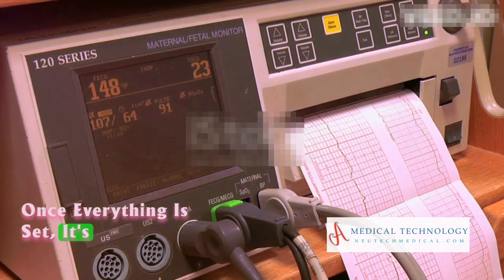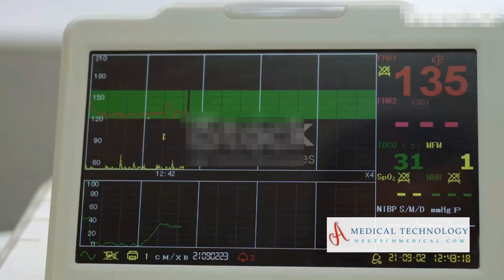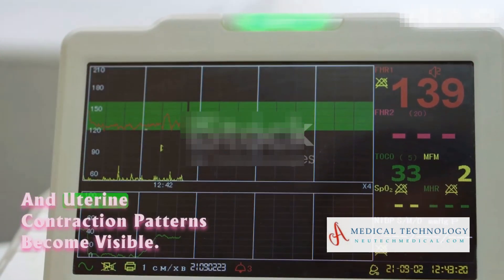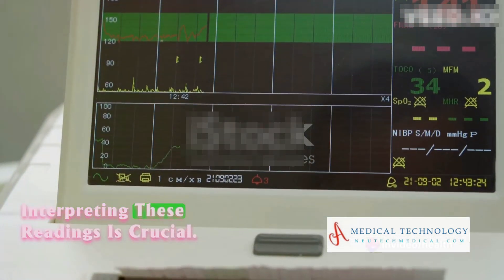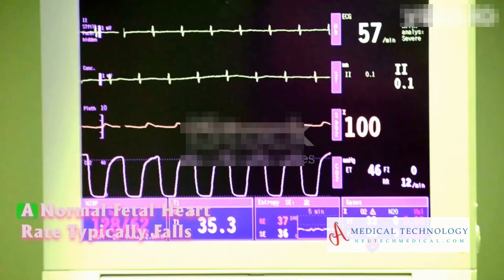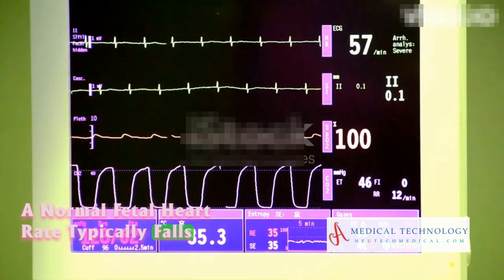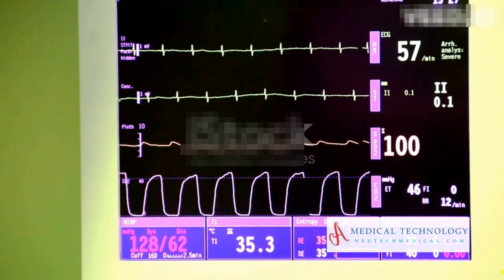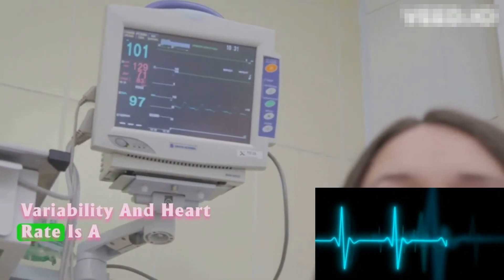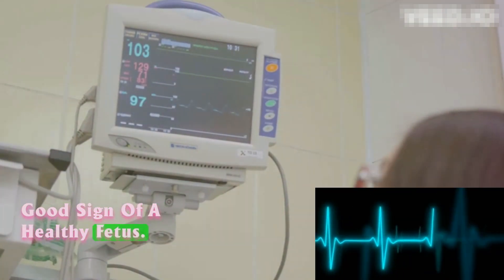Once everything is set, it's time to monitor the display. This is where the fetal heart rate and uterine contraction patterns become visible. Interpreting these readings is crucial. A normal fetal heart rate typically falls between 120 and 160 beats per minute. Variability in heart rate is a good sign of a healthy fetus.